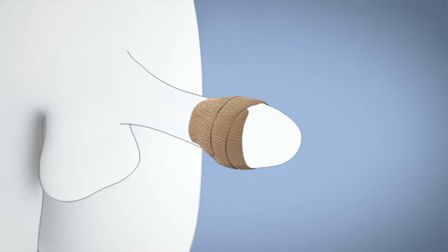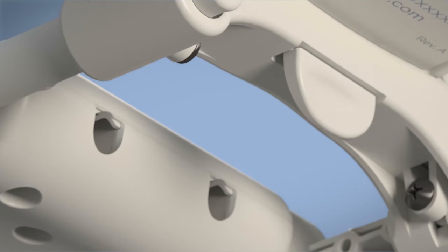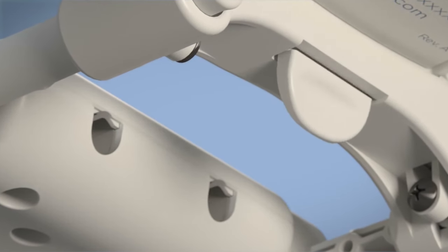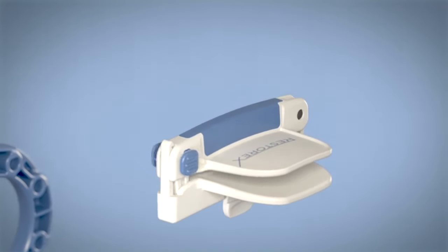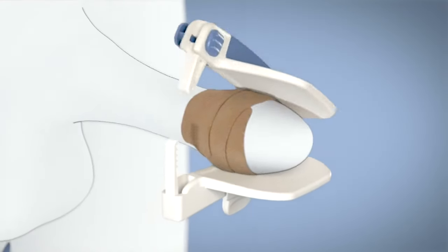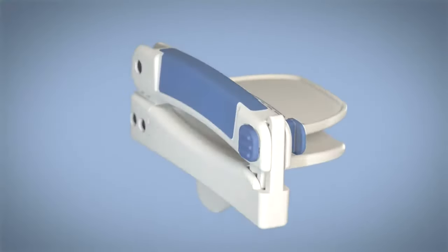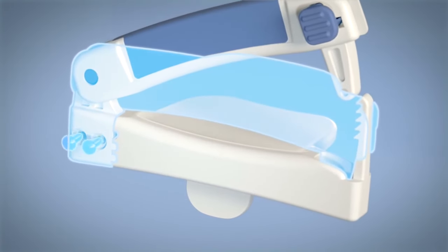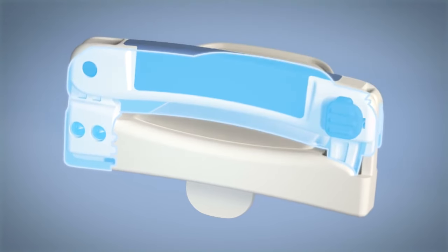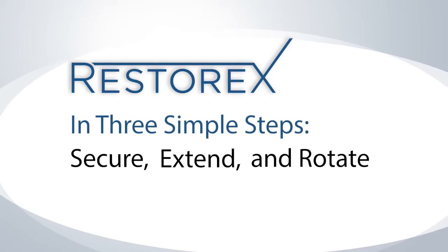Now to complete the setup, push the clamp release tab and remove the clamp from the housing. After opening, place your wrapped penis in it as shown. If you cannot close the clamp, or with it closed you do not believe you can comfortably wear it for 30 minutes, adjust the height as shown.